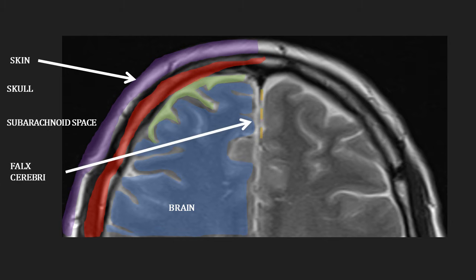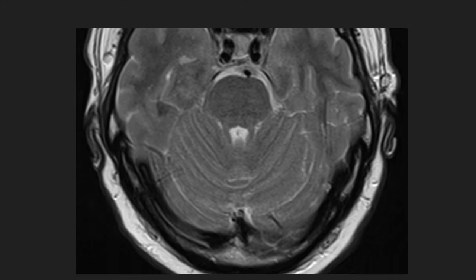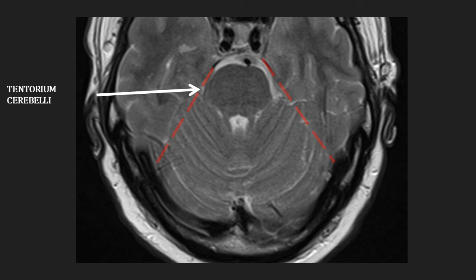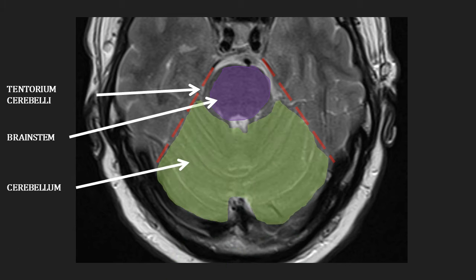The falx cerebri and tentorium cerebelli are exceptions in that they represent the dura and can be seen even in the absence of abnormality. Here, the falx is represented by the orange dashed line, and the tentorium cerebelli is more posterior and will be seen on the next slide. Looking at the posterior aspect of the brain, the red dashed line represents the tentorium cerebelli, separating the cerebellum from the cerebral hemispheres. The brain stem is highlighted in purple, anterior to the cerebellum, highlighted in green.